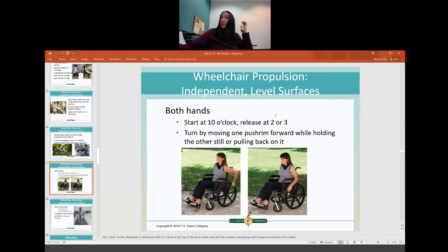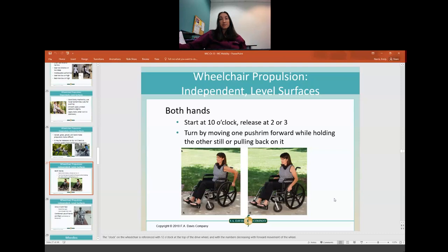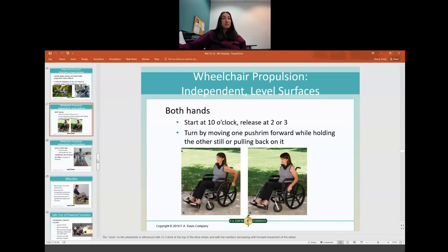For independent wheelchair mobility, imagine a clock on the wheels where 12 o'clock is at the top, 6 o'clock at the bottom. Moving forward goes to smaller numbers — 1, 2, 3 — and moving backwards to larger numbers — 11, 10, 9. You start with your hand at the 10 o'clock position, pull the wheel forward, and let go at about the 2 or 3 o'clock position. If you need help picturing that, picture the clock on the other side of the wheel for more accuracy.